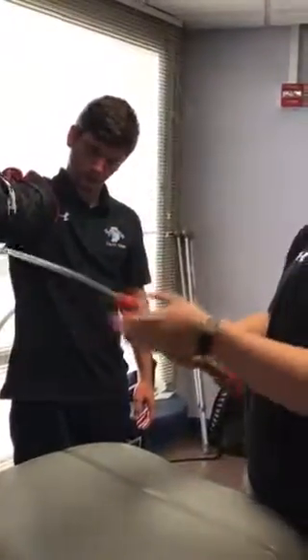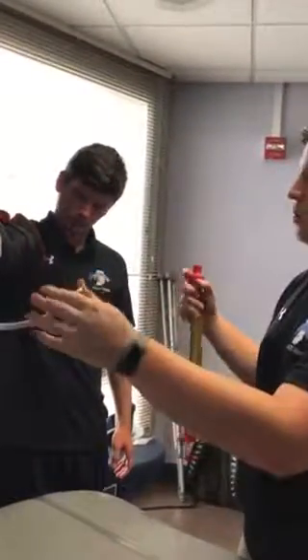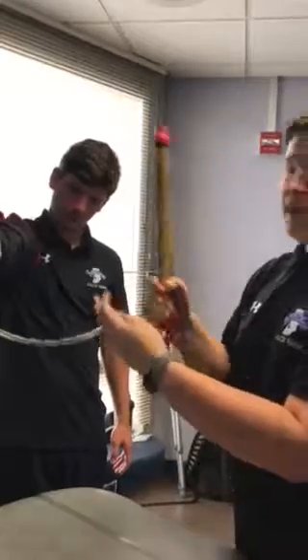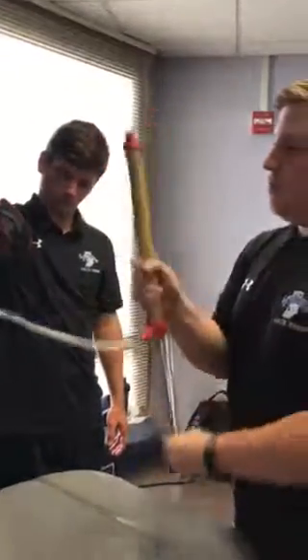Once this comes off, to get the air back into it, you can easily just detach the hose. Air will come back in. If that doesn't happen, you go ahead and put it on the top of the other part of the hose and just pump air back into it.